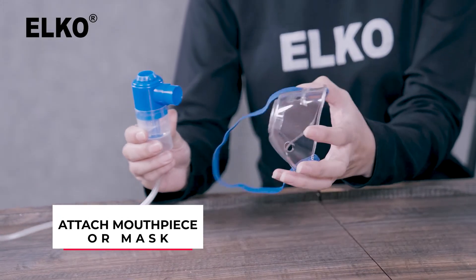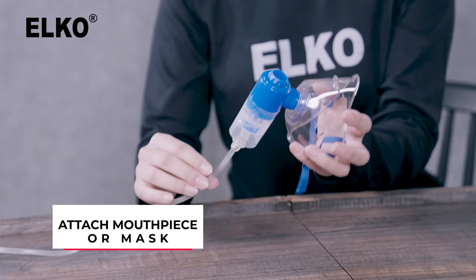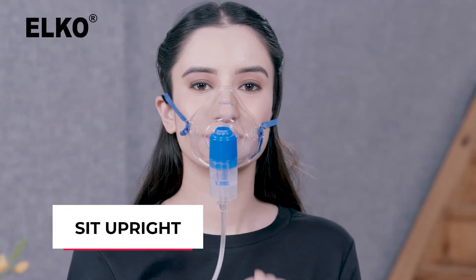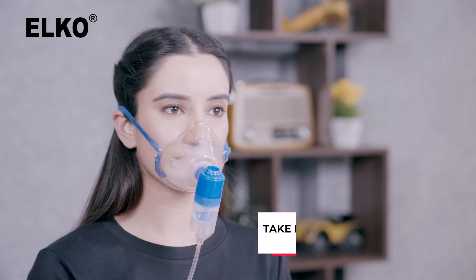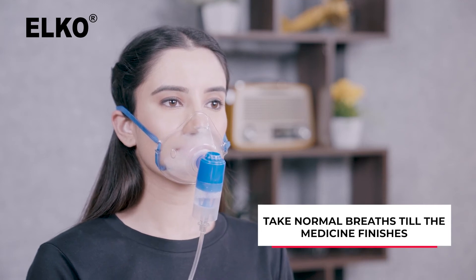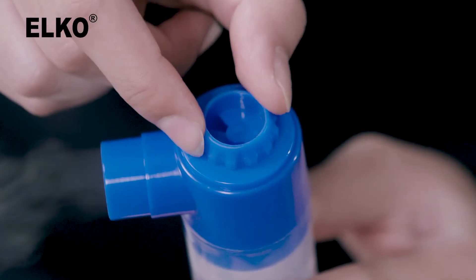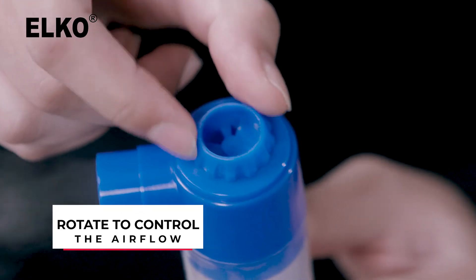Attach the mouthpiece or the mask as per your comfort at the top of the nebulizer chamber. Now wear the mask or hold the mouthpiece in your mouth while sitting upright. Press the power button to start the nebulizer and take normal breaths until all the medication is inhaled. This nebulizer also includes a flow adjuster so that you can take faster or slower delivery of your medicine. Simply rotate the adjuster clockwise and anti-clockwise to control the airflow.